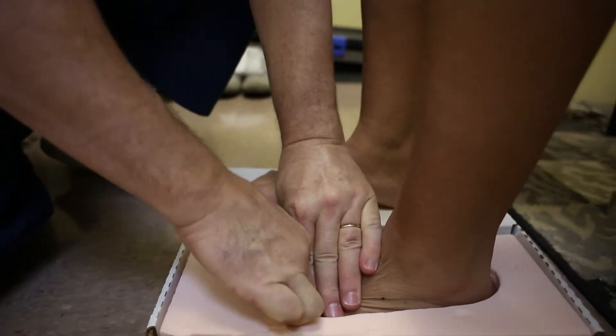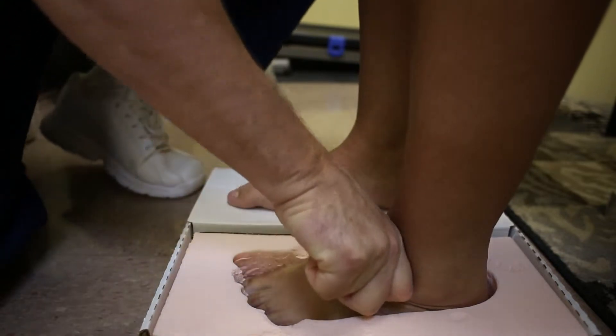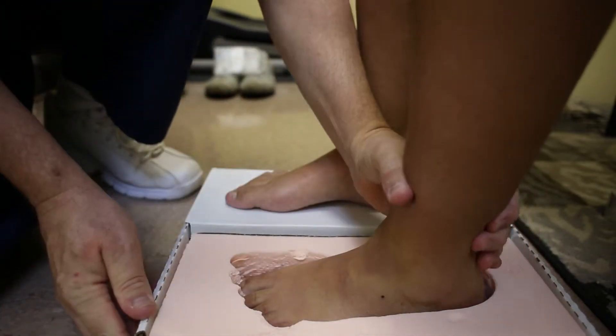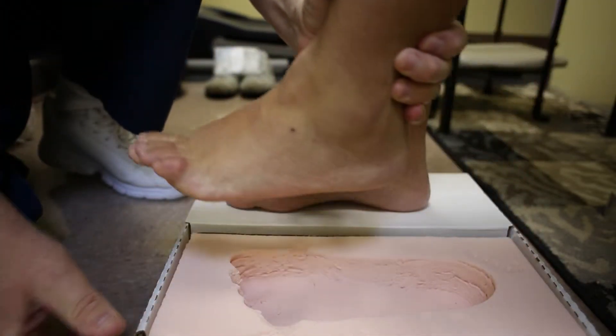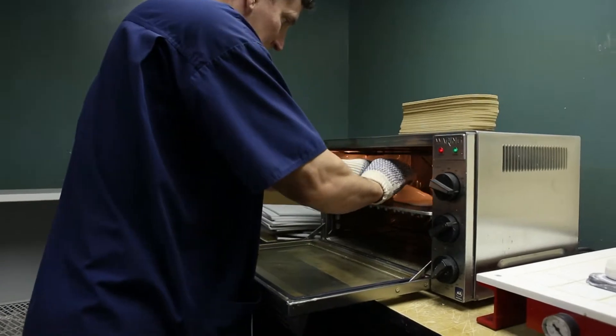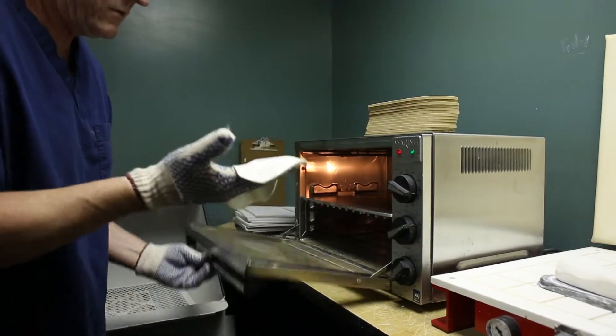A lot of foot problems can be corrected through orthotic devices. Here at the foot doctor, we can cast you for custom molded orthoses that we make in our own lab.